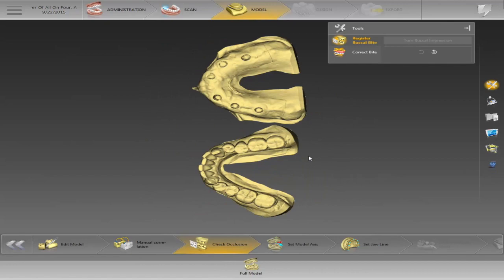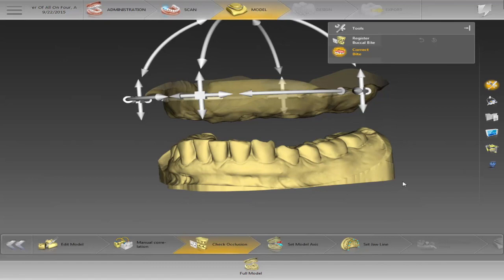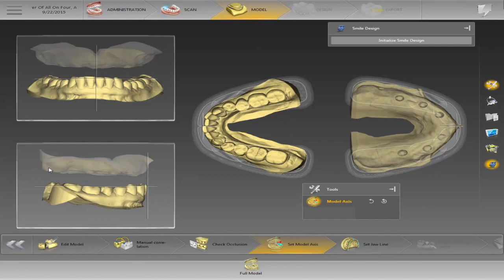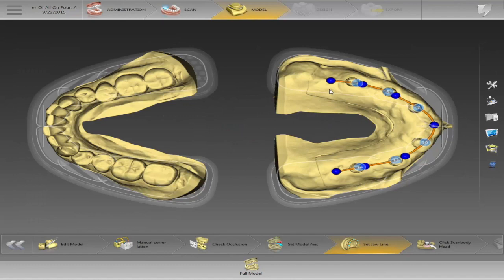I can check the bite once I have it positioned. If you get a first case and it has a bite registration, you just mount it with the bite — you can scan it in as a biocopy as well. We'll position the model here. Once we have it in position on the occlusal plane, we'll move forward. This is more or less just telling the software where we want the teeth and where the implants are.